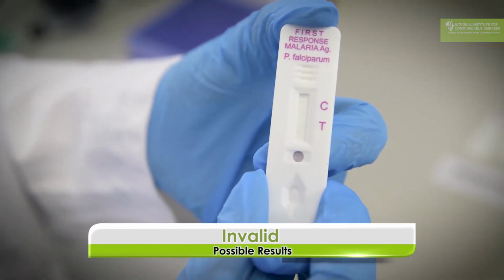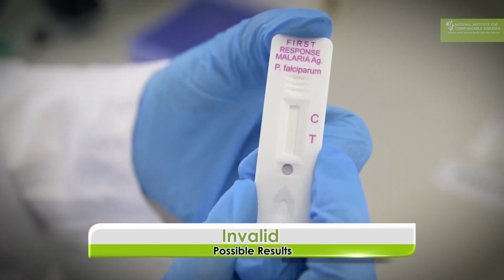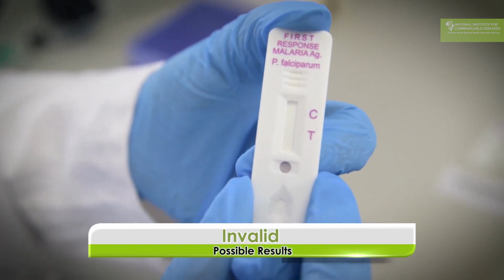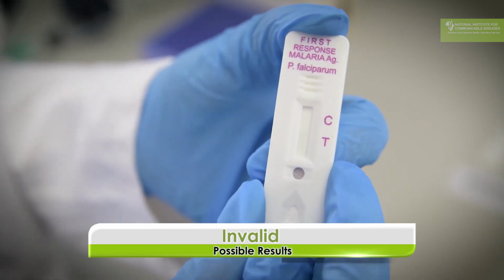This is another example of an invalid test because neither the control line nor the test line has come up, and you can only call a test if a control line has come up. You have to call this invalid and you have to repeat the test. So you have to start the whole process again with a new rapid diagnostic test and wait till you get a result, because you cannot send a patient off without a result, whether it is positive or negative.